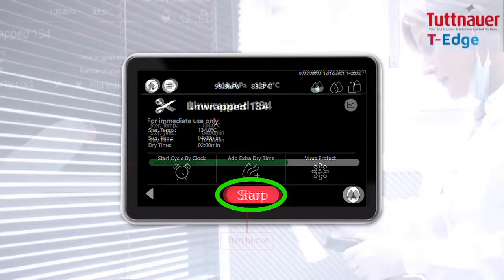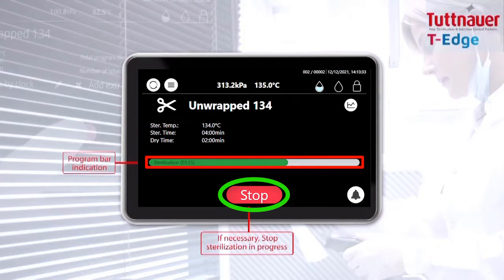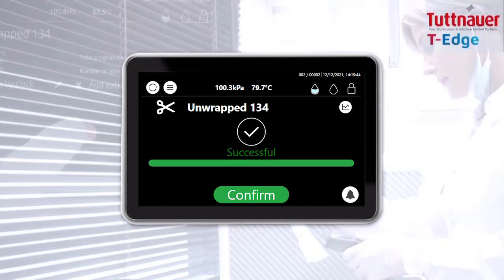For cycle progress, watch the indication bar. If necessary, press the stop button to stop sterilization in progress. Upon cycle completion, tap the confirm button.